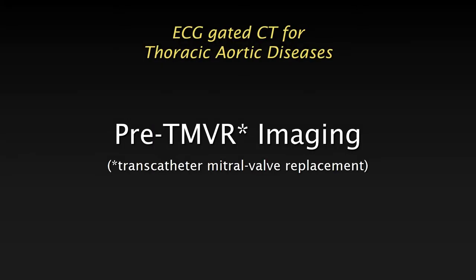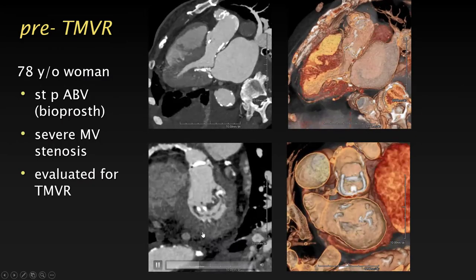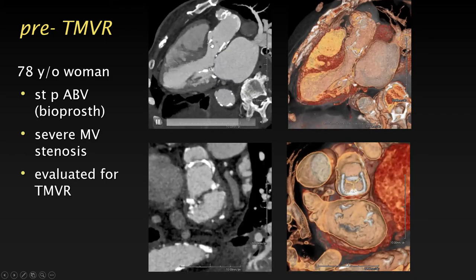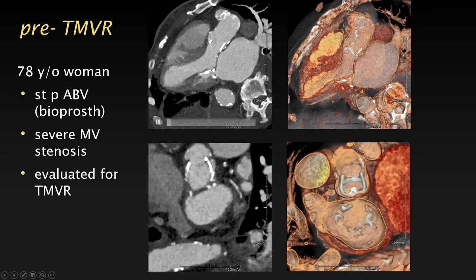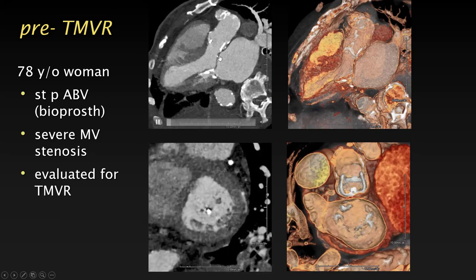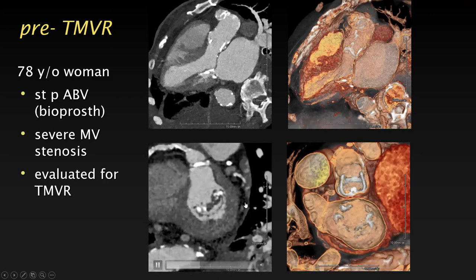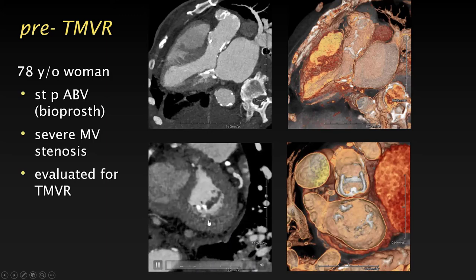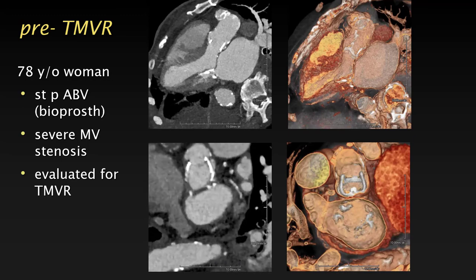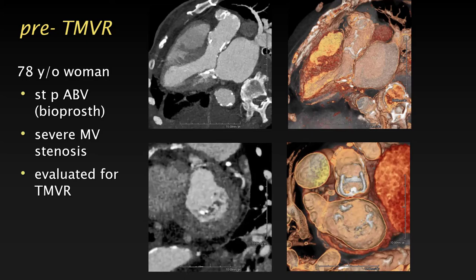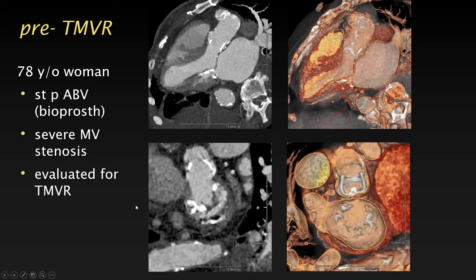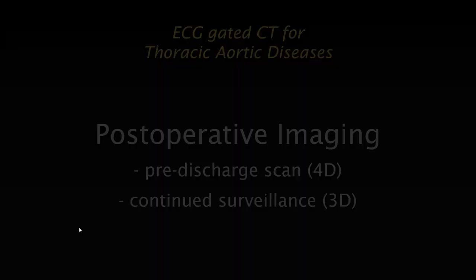Pre-transcatheter mitral valve replacement planning is even more sophisticated and difficult, but the principle is the same — you need a very high-quality study. Here we typically scan in 20 phases over the cardiac cycle. In this patient the anterior mitral leaflet should open like a gate, but it's totally stuck and the valve opening is a very tiny slot — severe mitral valve stenosis. The planning for mitral devices is more complex because the devices themselves are more complicated and must fit precisely within the mitral valve.